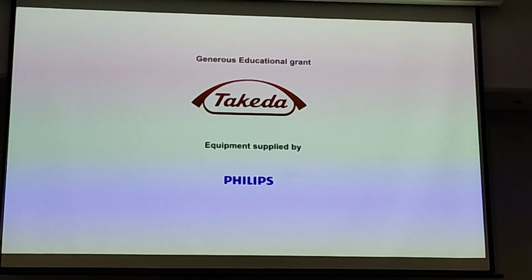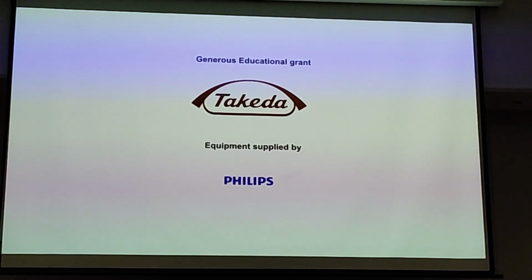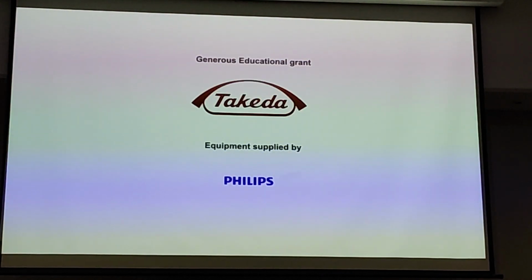The results are not as good for detecting, because it's also the structure of the lymph node, and there's a lot of subjective feeling about whether the structure is altered or not. There are small lymph nodes that contain malignant cells. So I would not trust ultrasound completely with respect to the detection of changed lymph nodes. This is, in my opinion, difficult, but every imaging has problems with that, right?